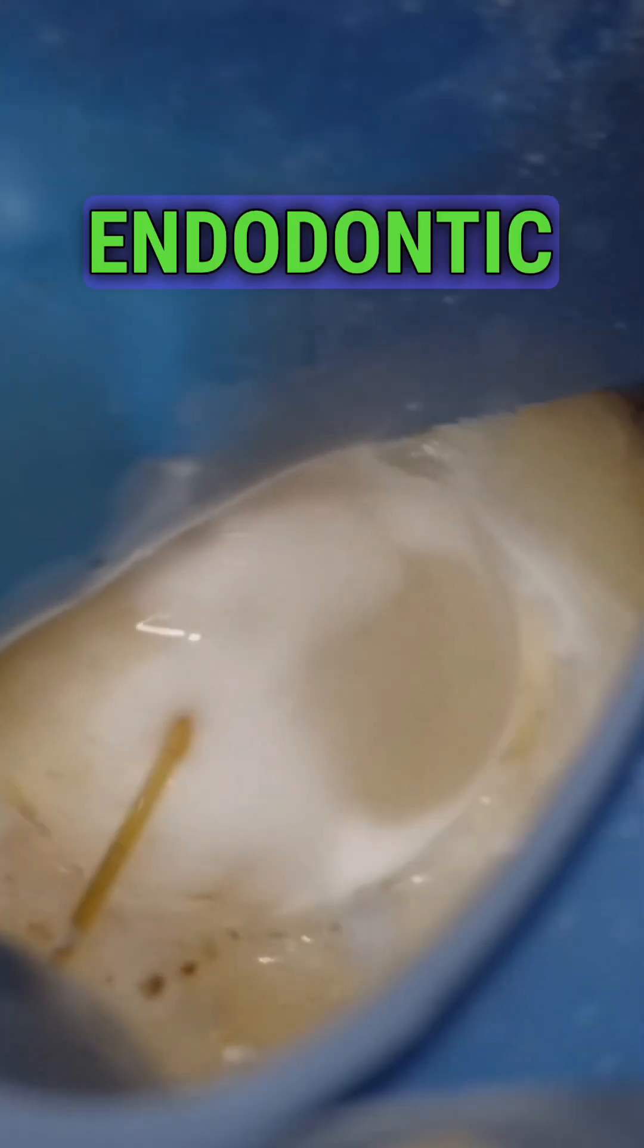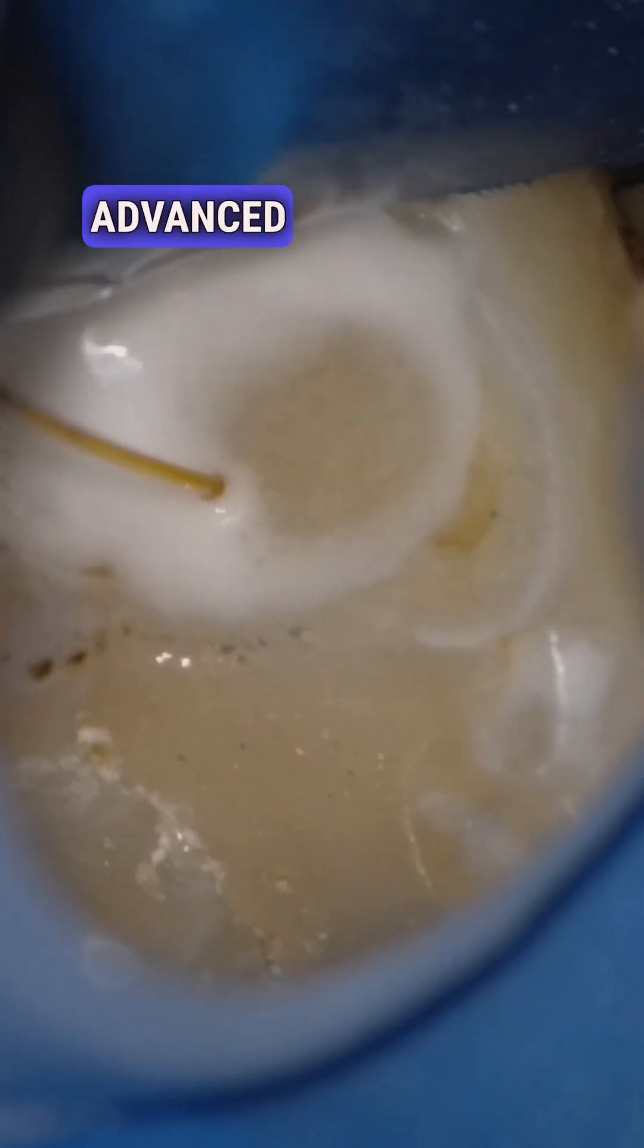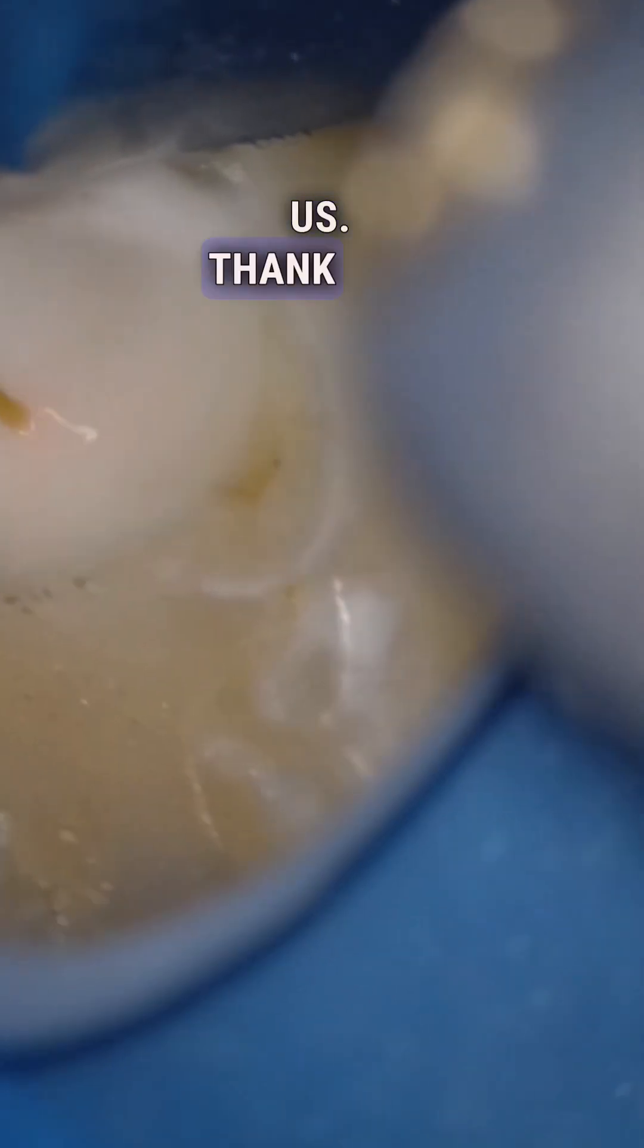So this is laser-assisted endodontic irrigation using the Edge Pro. And again, I think it's an interesting thing. We're in a day where we have advanced disinfection protocols and technologies that can help us.